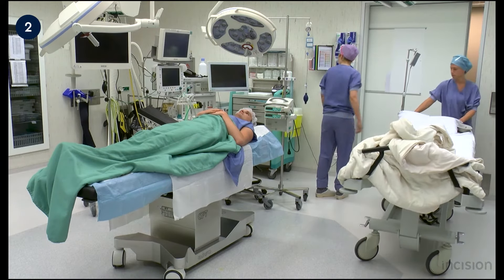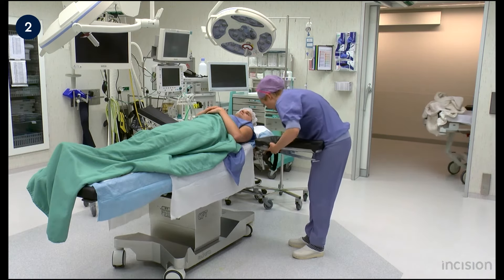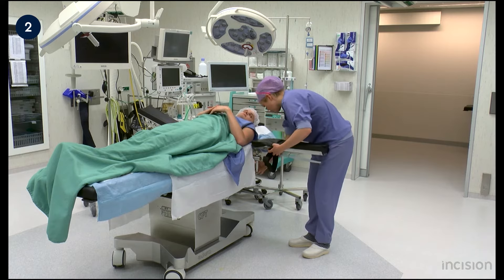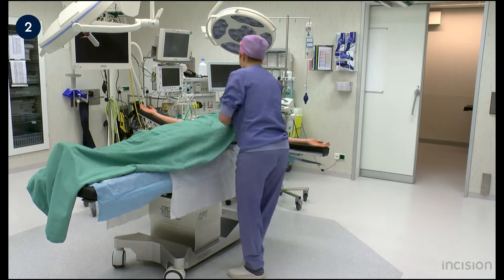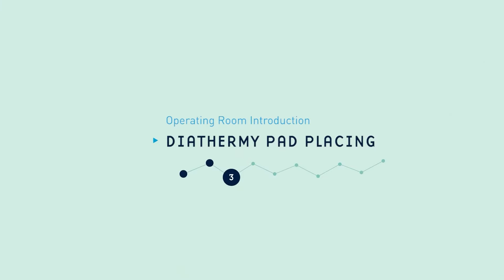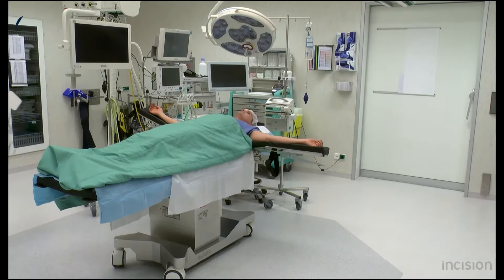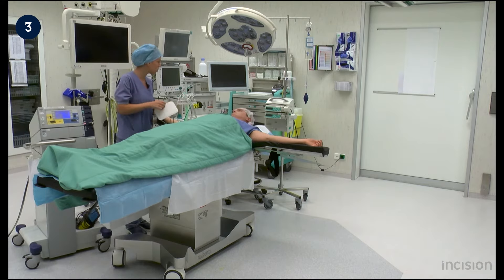The arm board is installed and the patient places his arms over the arm boards. To earth the diathermy, the pad is placed on a dry skin area such as the upper leg.